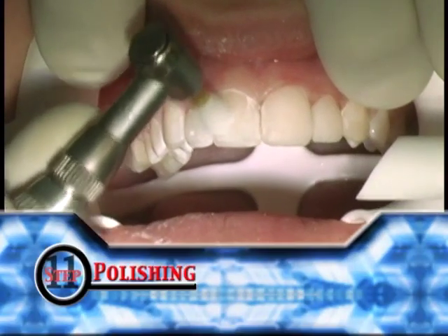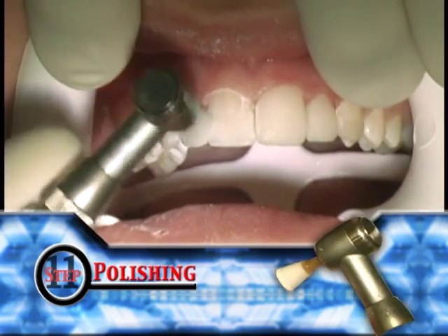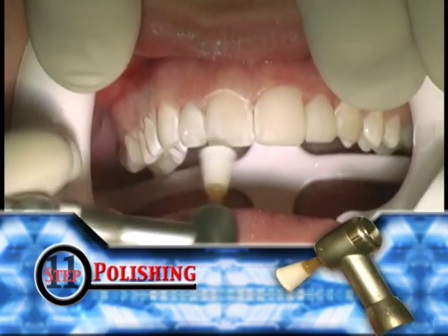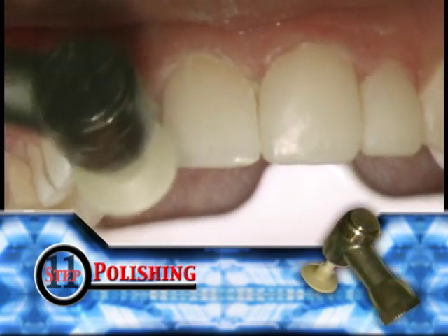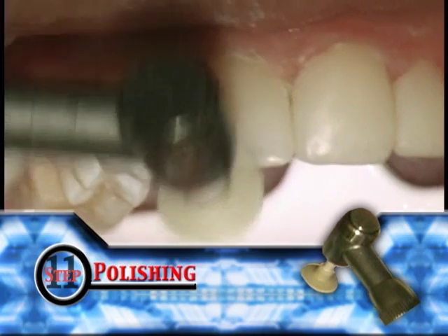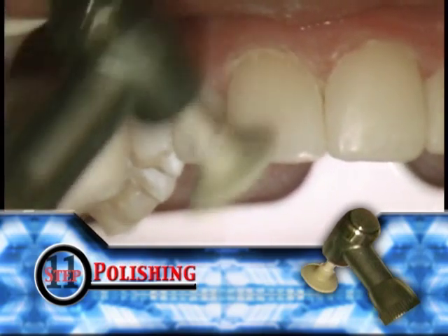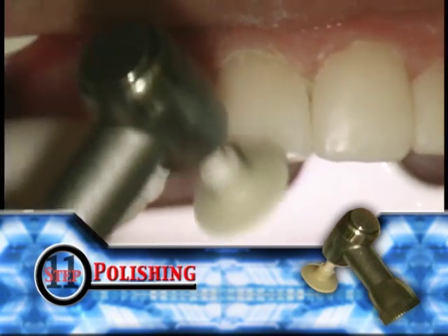During the polishing stage, we will use a composite removing polishing head that is similar to a gritty, hard sandpaper. This will remove the roughness. The final polishing disc is a diamond polisher called Pogo. Our dentists will use heavy pressure at first and then ease up on the pressure to create a high luster. You should be able to get under the gum line without causing a laceration.